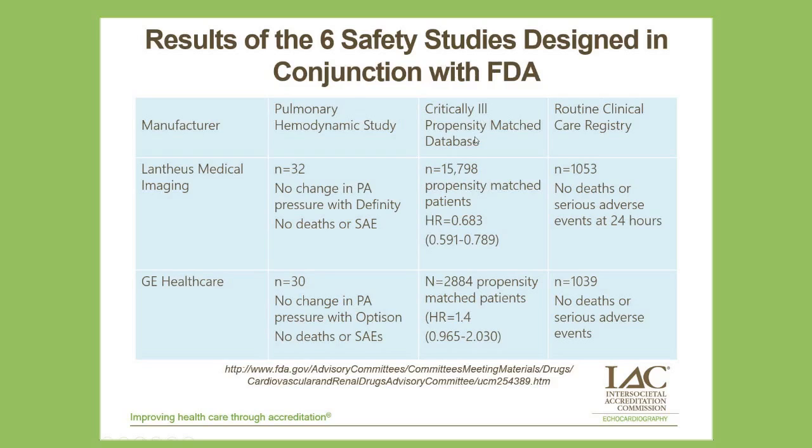In the critically ill propensity-matched database, a large number of critically ill patients who underwent echocardiography with a contrast agent were matched with similar patients who underwent echocardiography without a contrast agent. And as you can see, no increase in mortality in the contrast patients.